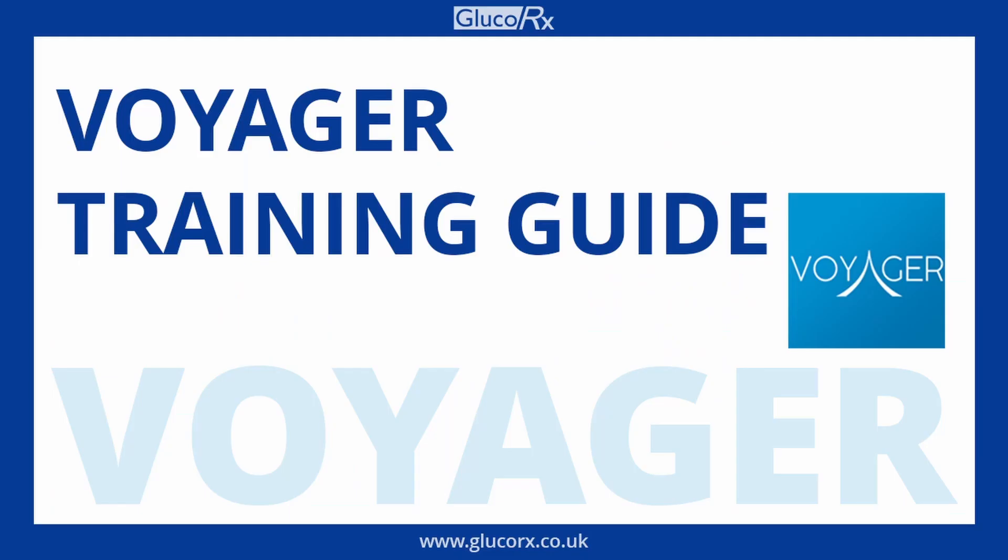Welcome to the training video on the GlucoRx Voyager software. This is an all-in-one health management system compatible with GlucoRx and GRx diagnostic devices for easy health data management and analysis.